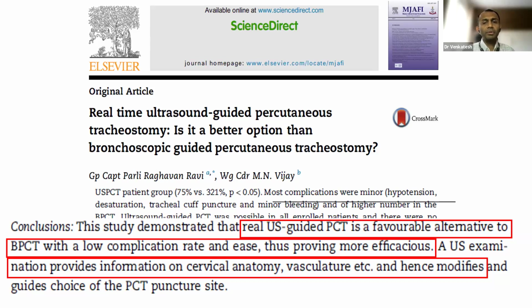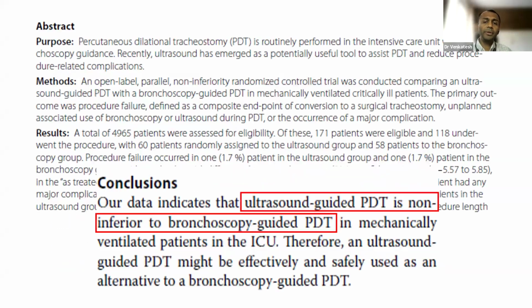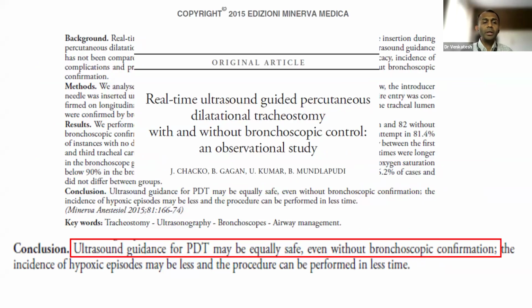Similarly, another study, a randomized non-inferiority controlled trial called the TRACKERS trial, compared ultrasound-guided percutaneous tracheostomy to bronchoscopic-guided percutaneous dilatational tracheostomy, which again showed that ultrasound-guided percutaneous dilatational tracheostomy is non-inferior to bronchoscopic-guided percutaneous tracheostomy. Another study clearly showed that you don't even need bronchoscopy to confirm the position. Ultrasound guided tracheostomy is equally safe and sufficient.